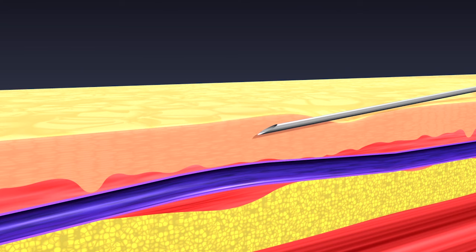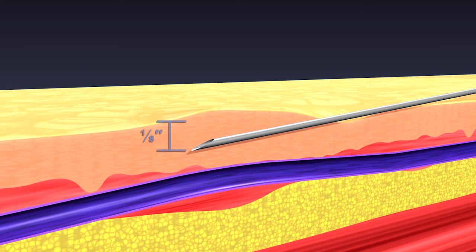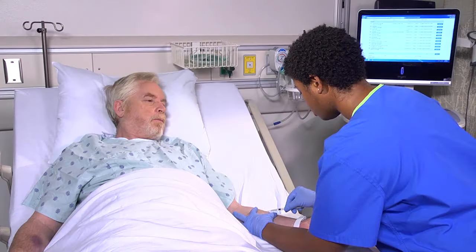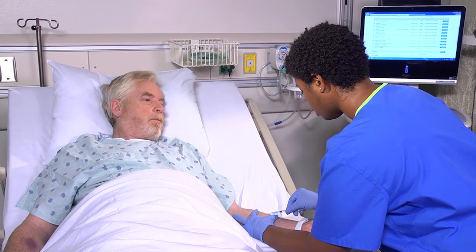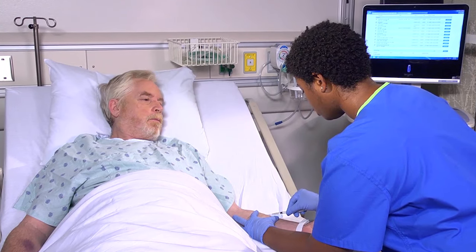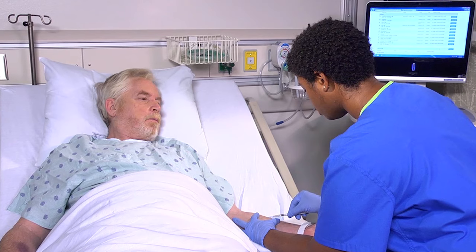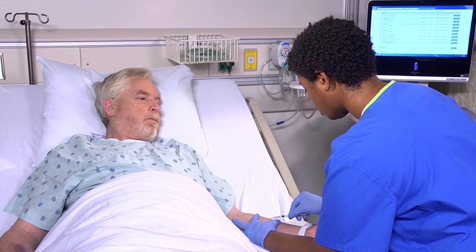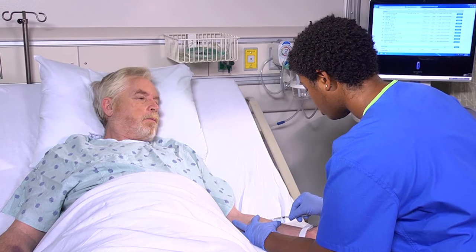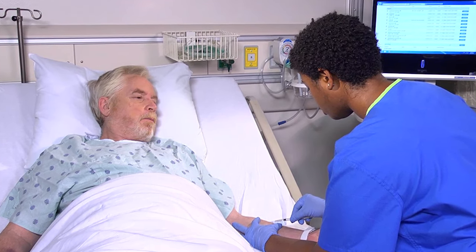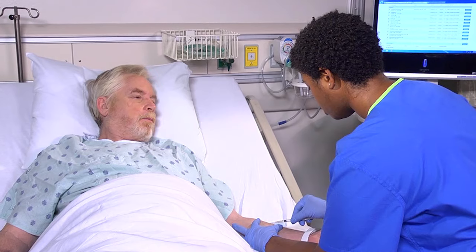Advance the needle through the epidermis to a depth of about one-eighth of an inch or three millimeters. You'll see the slight bulge of the needle tip beneath the skin. As you slowly inject the medication, you should feel resistance. If you don't, it's likely the needle is too deep. Withdraw it and begin the procedure again.